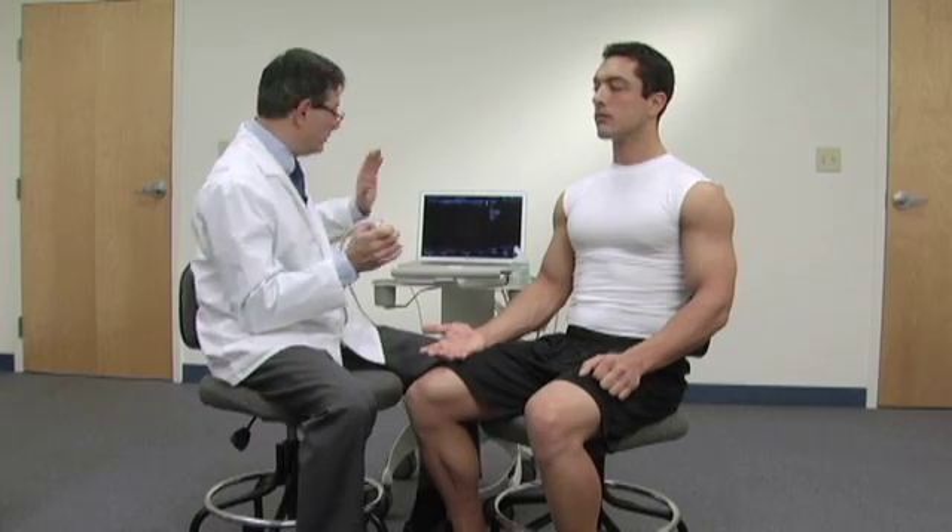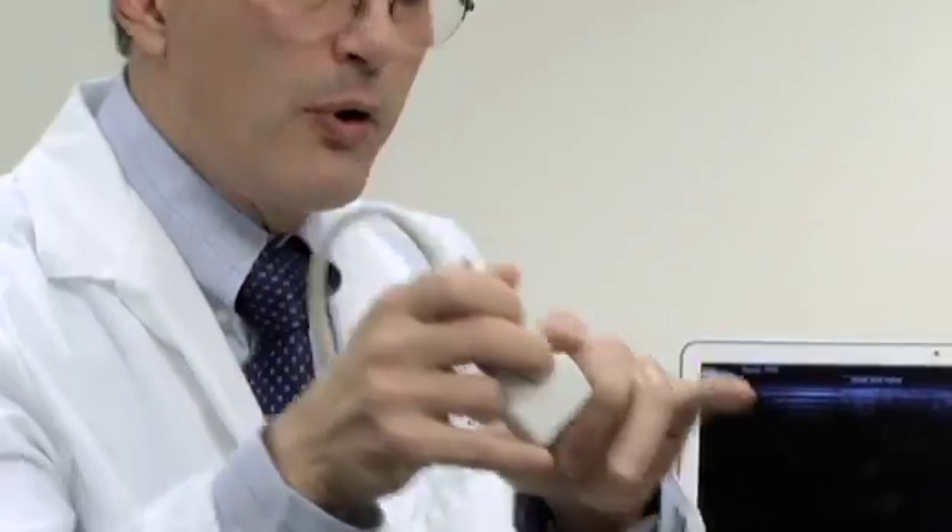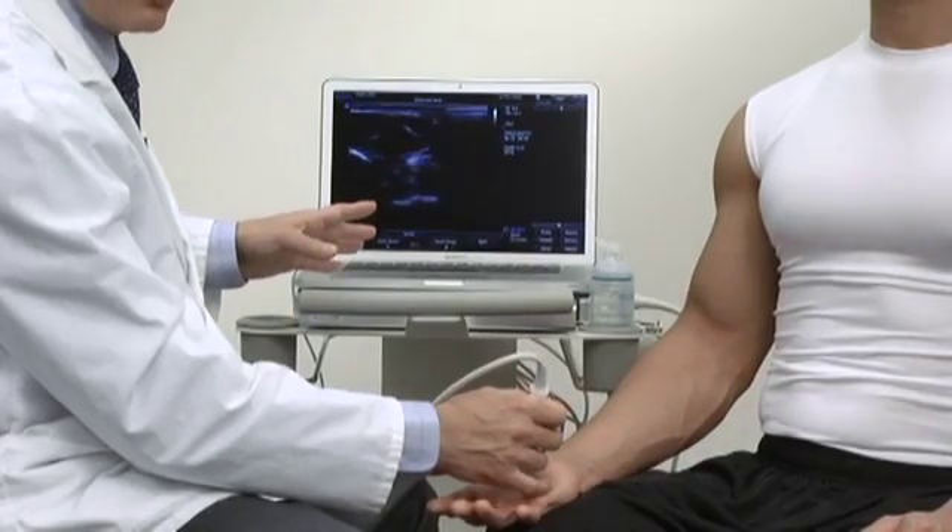When you're first learning to perform an ultrasound examination, it's very helpful to position the ultrasound machine such that your left eye is to the notch side of the probe and to the screen. This way, when you move the probe to the left side, the image will be moving towards the left, and when you move to the right, you'll be moving to the right.